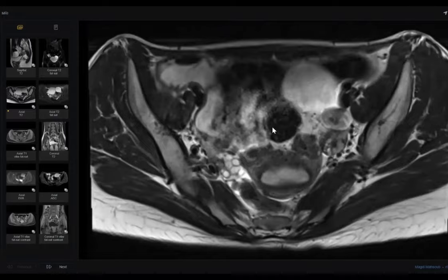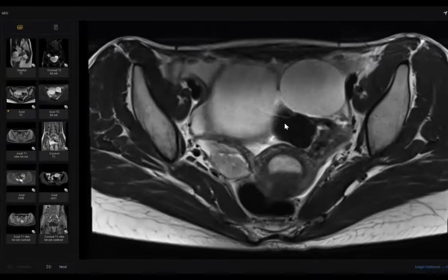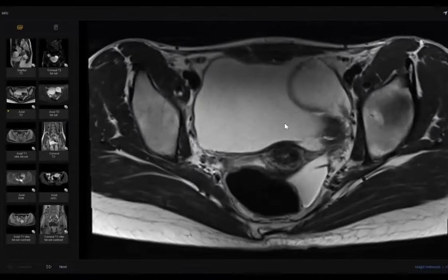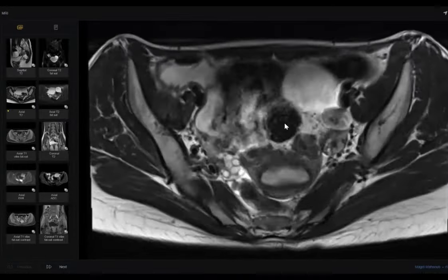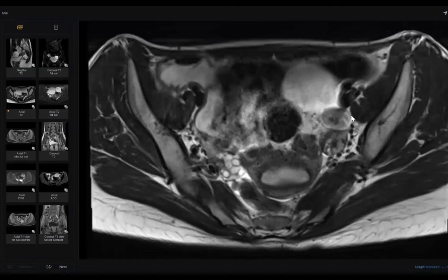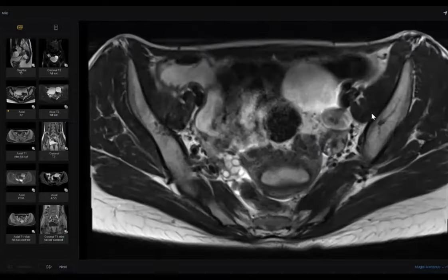I think this is bowel. Don't think about this one. I think, or maybe pedicle. Yeah, maybe the pedicle. But the most, this is the cyst. Sorry, this is the ovary. Okay, this is the pedicle. This is the pedicle. I think this is maybe bowel. So follow from the ovary, then something here. Look up and down. It is the whirlpool sign, or twisting around itself.